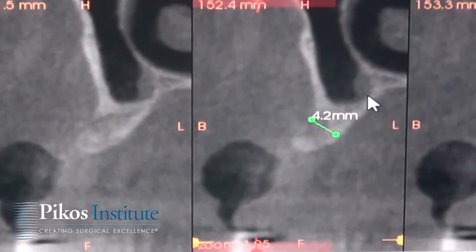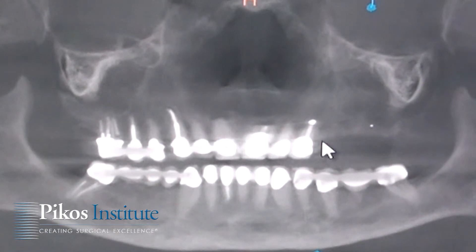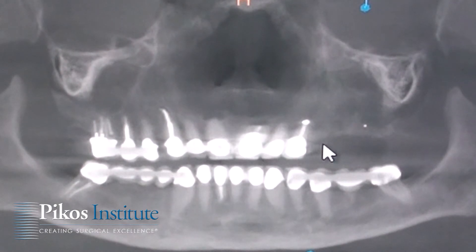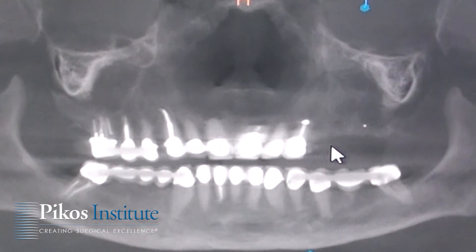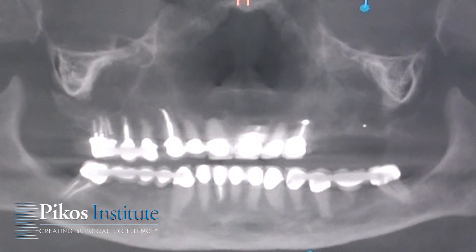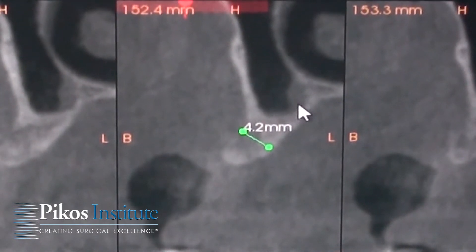As we'll see intraoperatively, we have a couple of options. One would be to ideally place both implants after splitting this ridge, which is the goal — to split this ridge and place two implants with simultaneous particulate grafting. Plan B would be to split this only, graft, and not place implants. And many times in these cases, I will not only split the ridge but also perform a veneer graft for even enhanced augmentation on the facial.